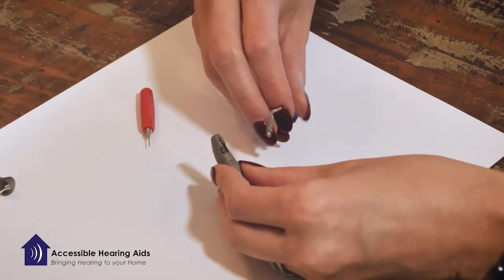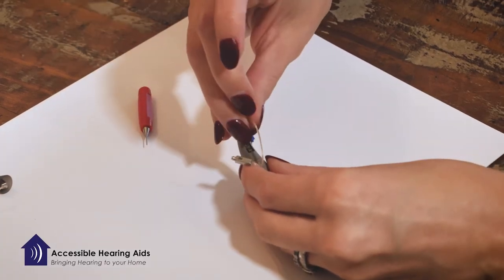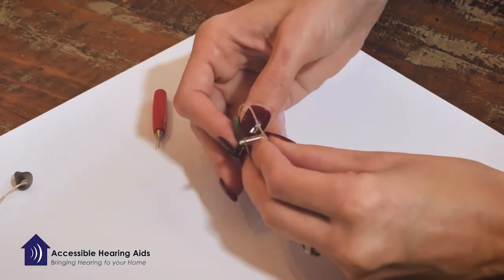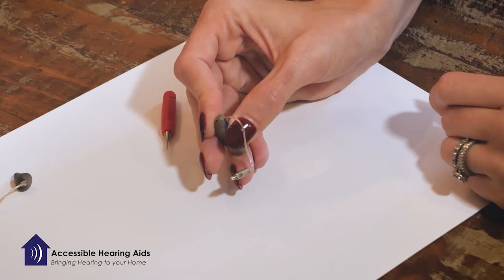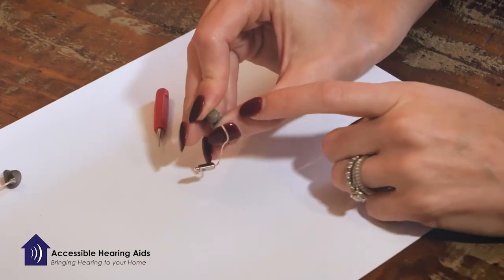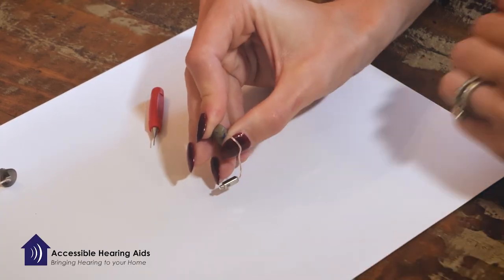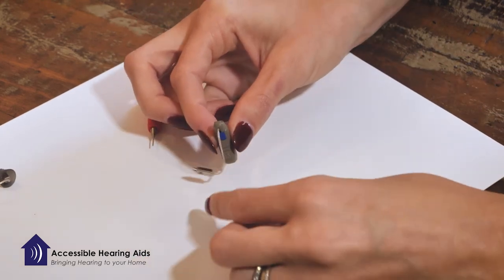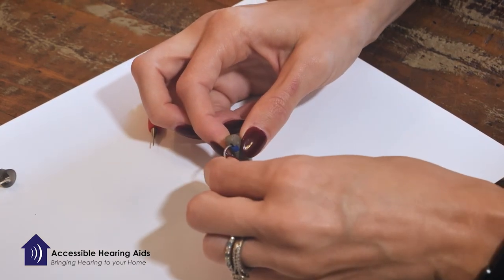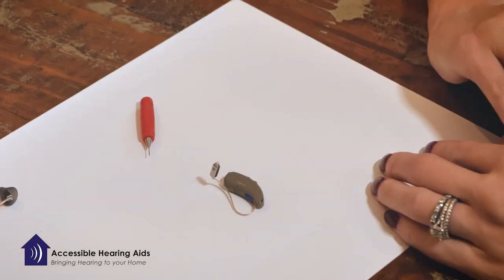It will need to click into place, so you will take the wire with the pin pointing down and hold it in place with your thumb — don't let go. Then push the triangular piece that is poking out back flush against the hearing aid. If you then pull on the wire, you can tell it is permanently stuck in place and you are ready to go.